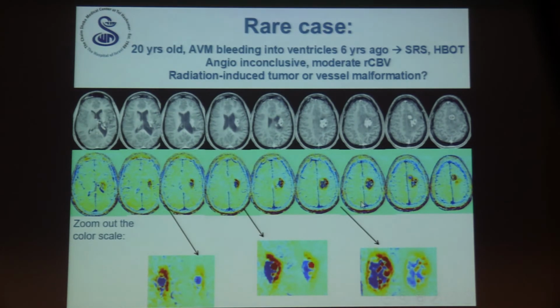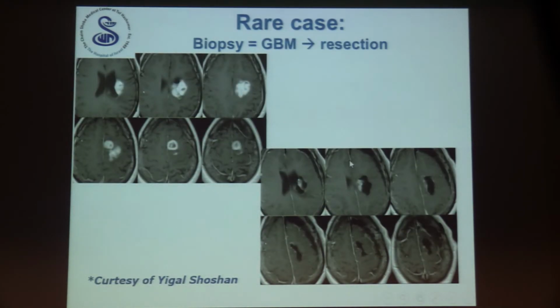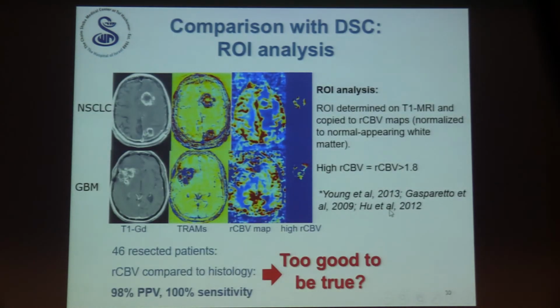And we couldn't really help much. Usually we have scanned like 12 or 15 AVM patients, and an AVM, when it's untreated, does look black in the trams. Usually it has kind of a vascular structure, so we were trying to play with the contrast here and see if we see a vascular structure, but we didn't. It looked kind of massive, but we didn't really have the courage to say we don't think it's a vascular structure. He was really afraid to biopsy it, if it was an AVM and she would bleed, but in the end he did biopsy it, and it was GBM. This is how it looked post-resection. At the time she was fine, I didn't follow.